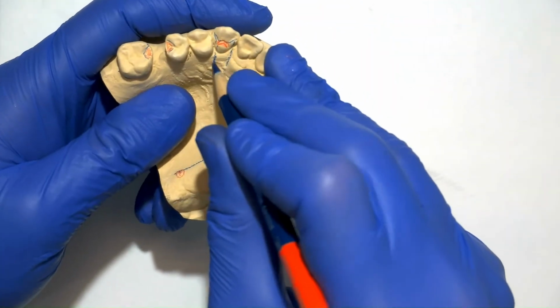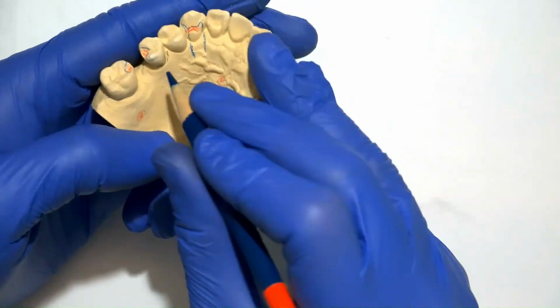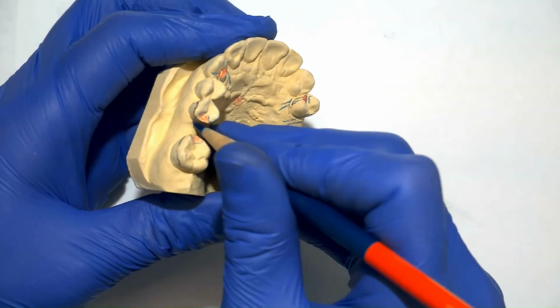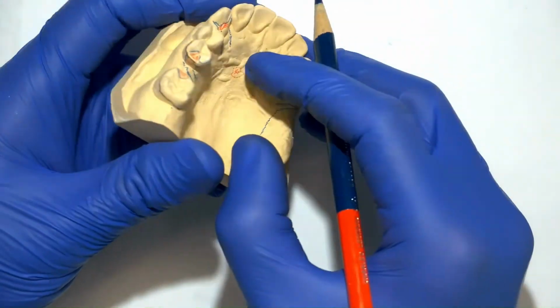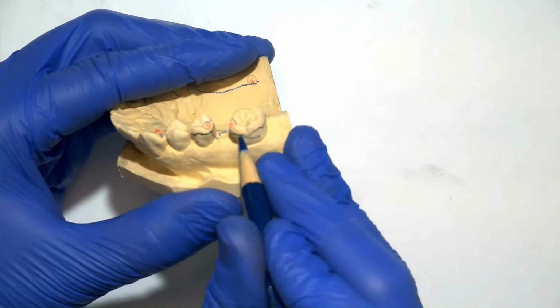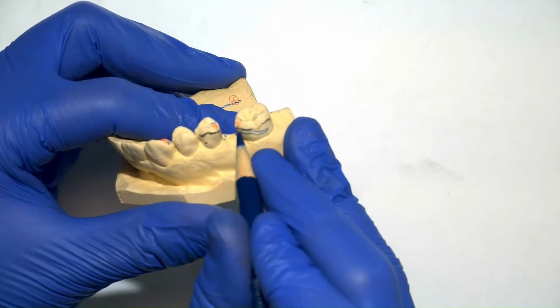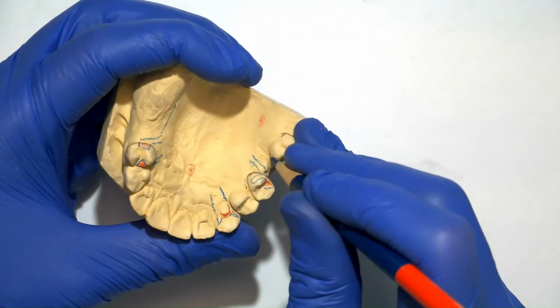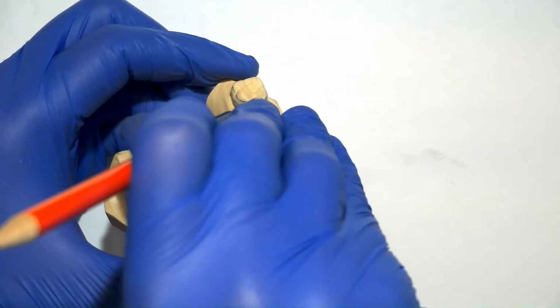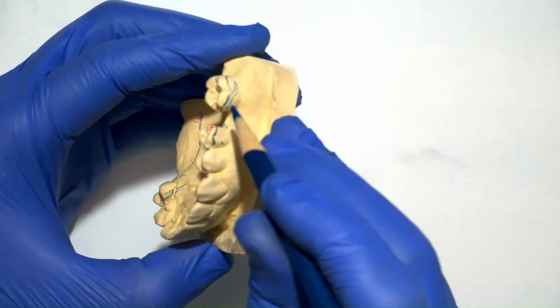To draw the minor connectors related to these two teeth, we'll have to start drawing the clasps. So we'll start with the reciprocal arm of the wrought wire clasp. Then we'll start drawing the cast circumferential clasp. Remember that only the tip of the retentive clasp goes gingival to the height of contour, and the reciprocal clasp stays above the height of contour throughout its existence. We'll then draw the minor connector right here.